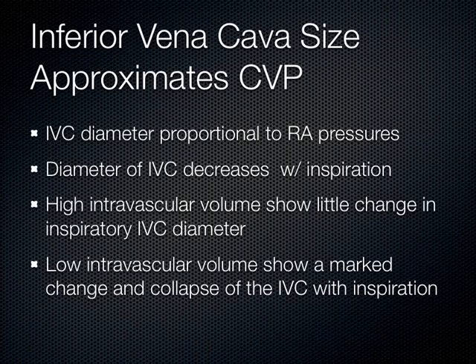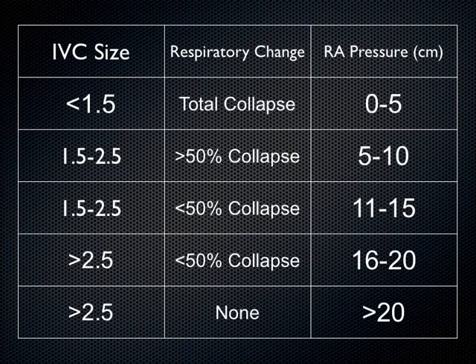You give the patient more fluids or less fluids based on the CVP. And that's especially true when you have patients who are in shock, like septic shock. And so that's where this all kind of will play in for you later in your clinical years. But I just want to give you that sort of preamble right now that you can actually estimate the right atrial pressure non-invasively by looking at the diameter of the IVC and how it collapses during inspiration.